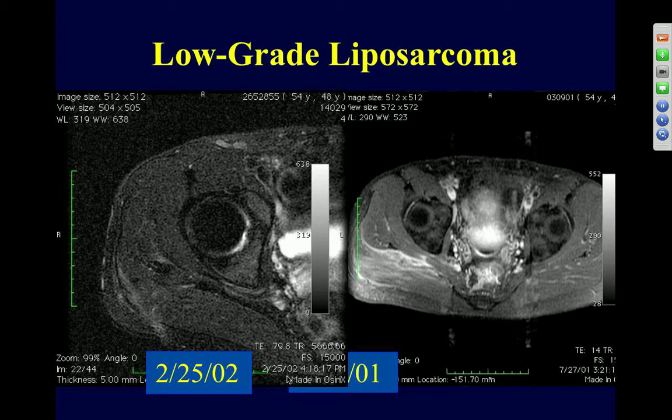one of our local institutions here, whenever the patient came back, the imaging protocol was completely different. In fact, it turned out when I went back and had to review these, they had about 7 or 8 MRs, and there were no 2 dates where they had T1 weighted images in the same plane to compare with. And I just want to bring this up as something, when you get out into practice, there's something very important about having stable protocols that are the same when you bring people back.